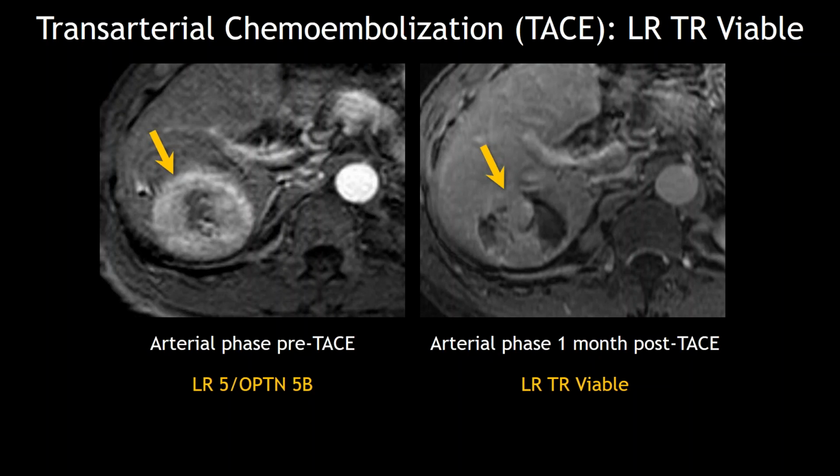It's not a radiation therapy. So I guess that's a good point. I should change this arterial here, but there is still enhancement of this. Okay. That's the tumor. And since you have enhancement, you know it's viable. Okay, because it's not completely necrotic. Exactly. And this is what it would be if it was necrotic.